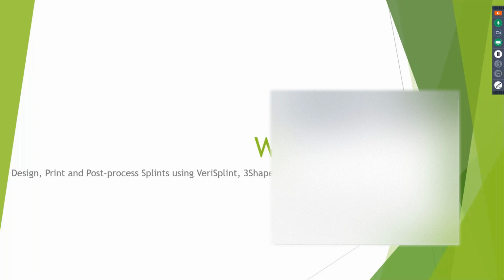What percentage, if any, is the shrinkage factor? So there's definitely going to be shrinkage. However, it is compensated for in the INI file. The INI file is the specific resin profile that you use in Asiga Composer when you're printing these splints. So the shrinkage factor is compensated for already in that INI file.